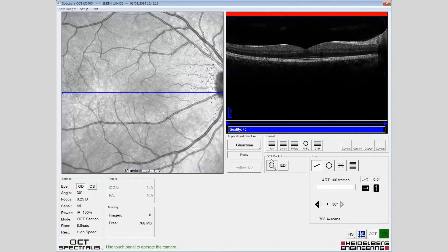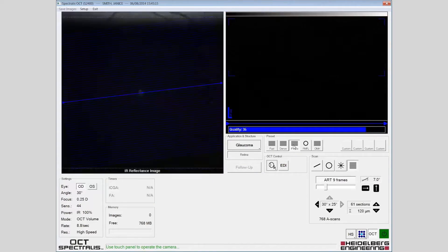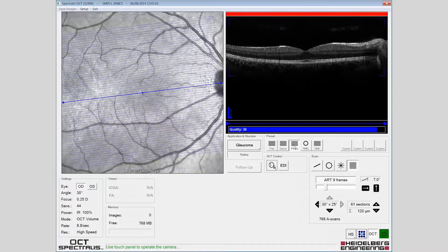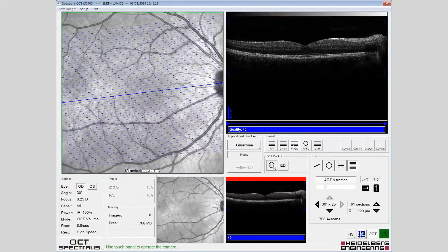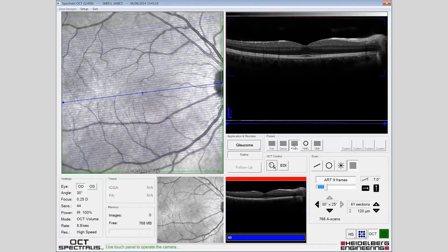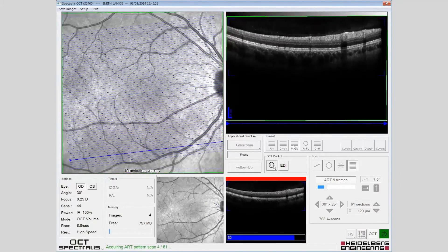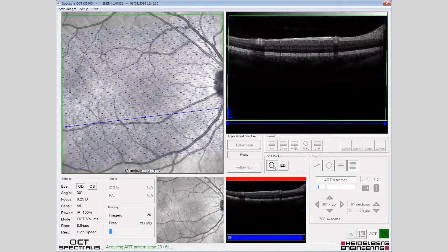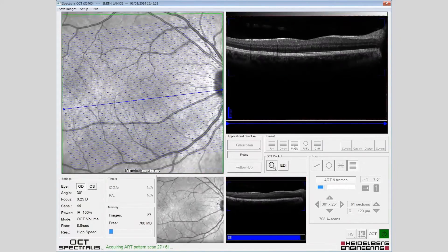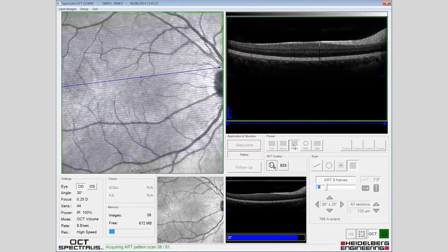To assess the retinal nerve fibre and ganglion cell layer, first select the posterior pole scan from the glaucoma presets. The scan should be acquired and the position of the OCT should be monitored during the acquisition.